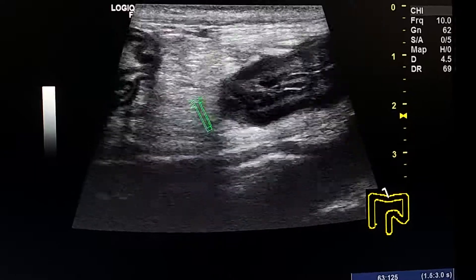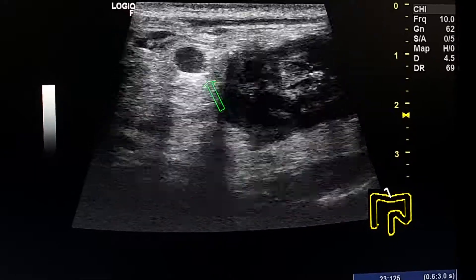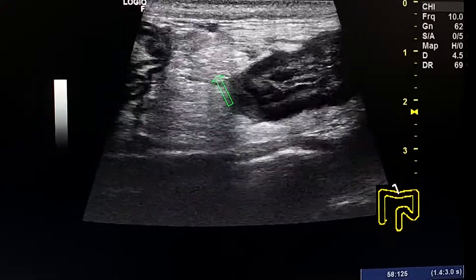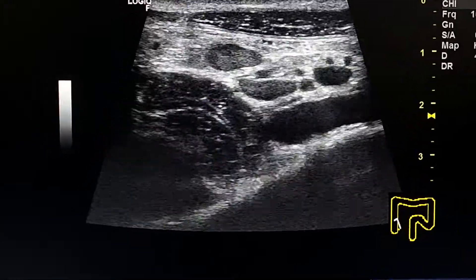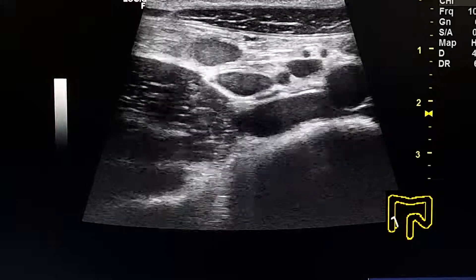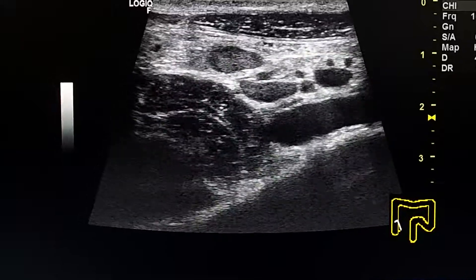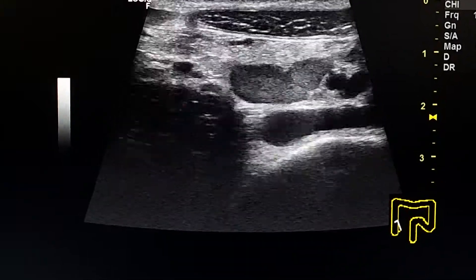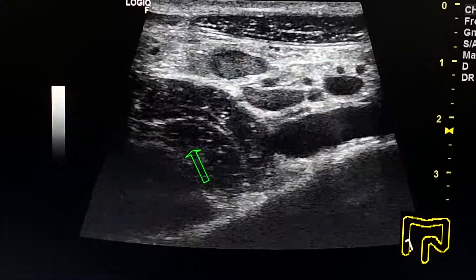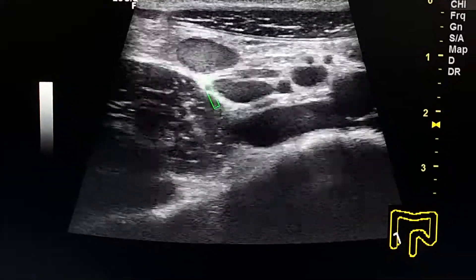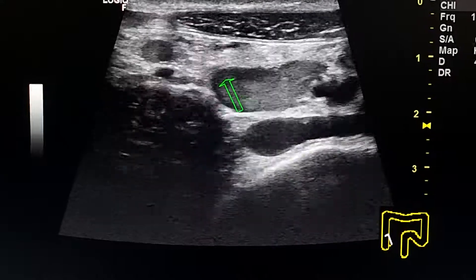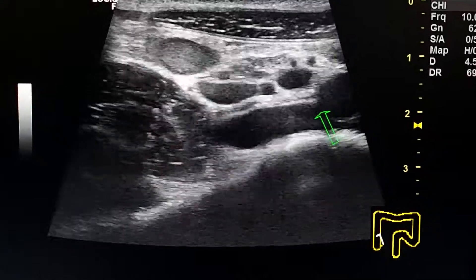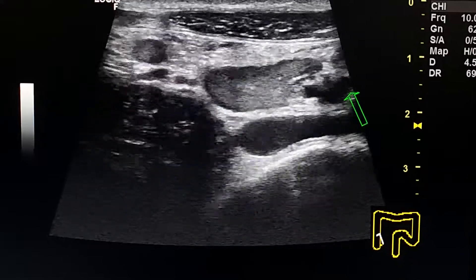We see echogenic fat and reactive lymph nodes. This is the right iliac fossa. We see mesenteric lymph nodes and the psoas muscle. These are enlarged mesenteric lymph nodes in the right iliac fossa.